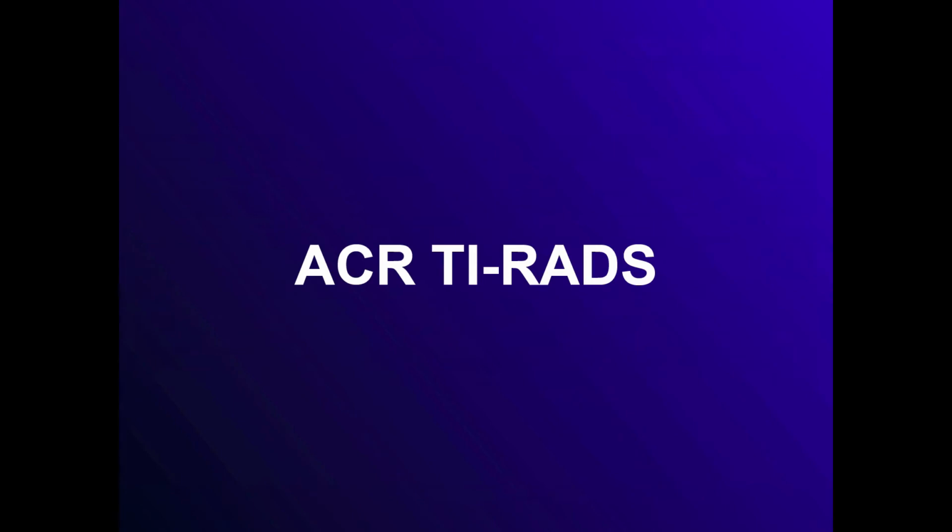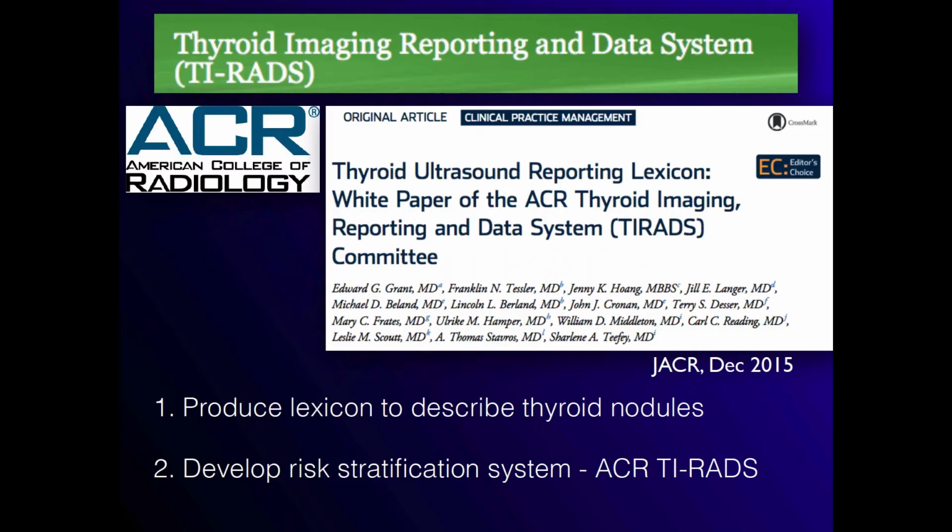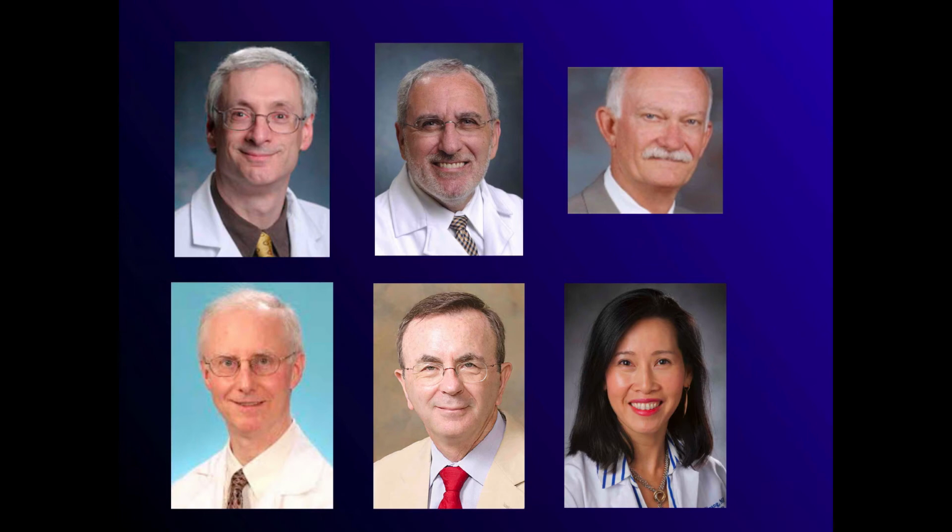So then comes ACR TI-RADS. This was first started off as a paper in 2015, just with a lexicon of what categories to describe based on the current literature. The committee, as you can see, consisted of about 15 members. And then after that was published, we worked on developing management recommendations based on the combinations of those findings. I was one of 6 committee members that broke away from the rest of the committee, and we developed the initial model, and then that was up for discussion, and it really didn't change very much after that.